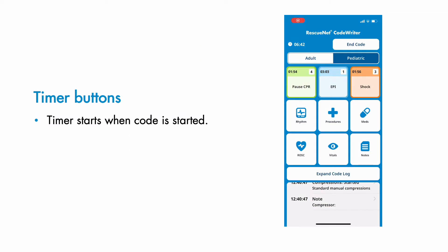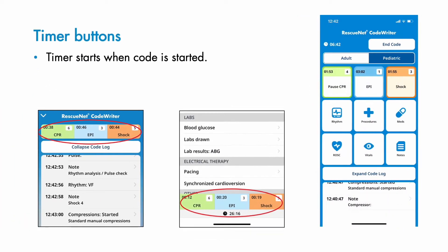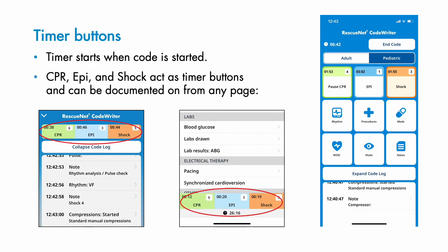When Start A New Code is tapped, a timer begins and remains visible on the screen throughout the code, so you always know how much time has elapsed. The top row of buttons include CPR, Epi, and Shock. When any of these three buttons are tapped, they begin keeping time. All three are accessible from any therapy page and can easily be tapped from any screen to document information without returning to the home page.